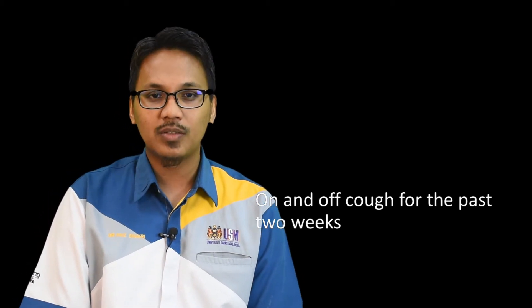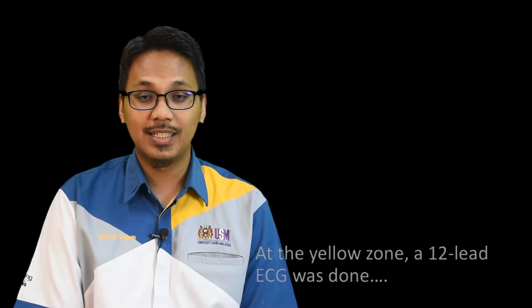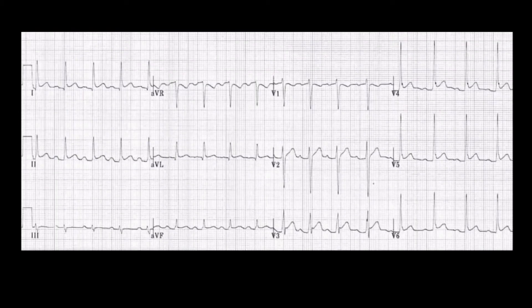At the yellow zone, a 12-lead ECG was done. This is the ECG of our patient. As you can see, there is a widespread ST elevation as well as a widespread PR segment depression. There is also a reciprocal ST depression and also PR elevation at lead V1 and also lead AVR.